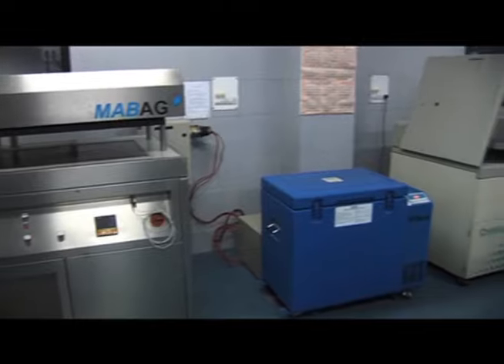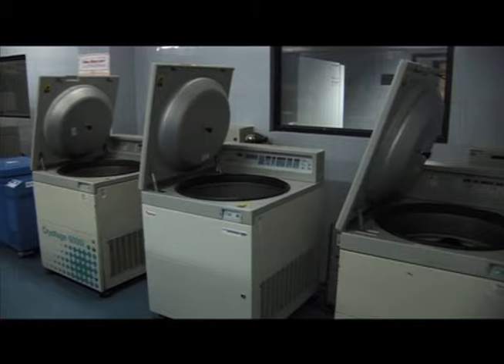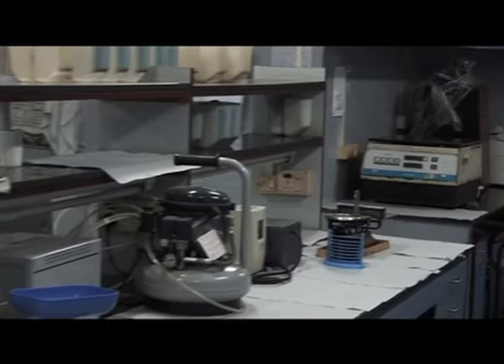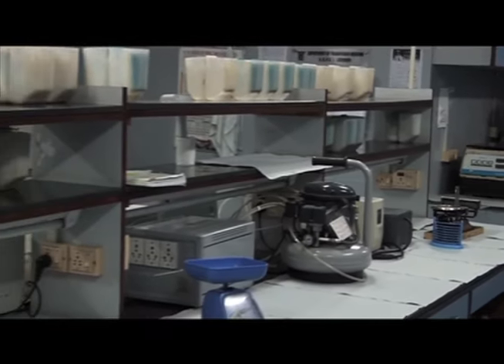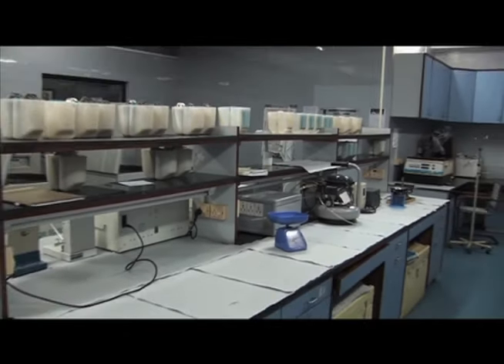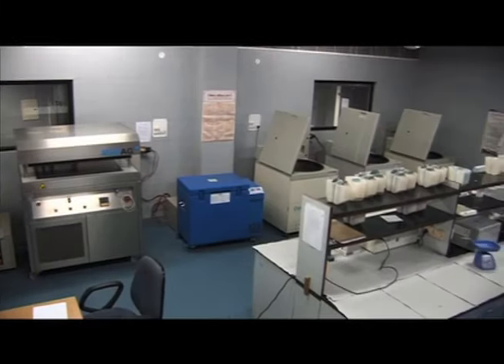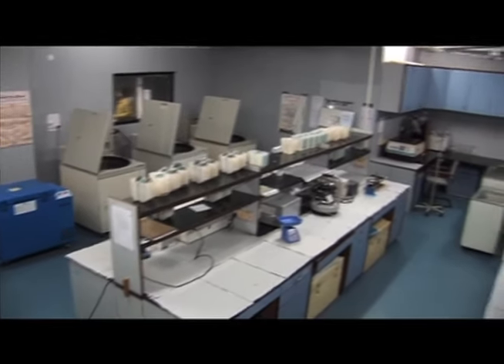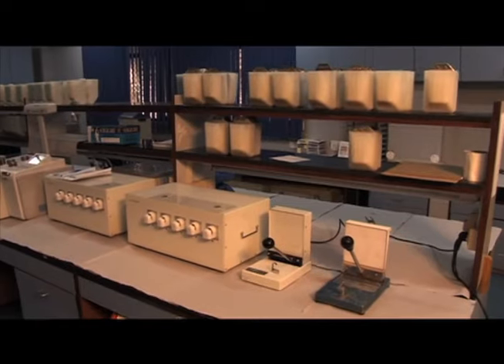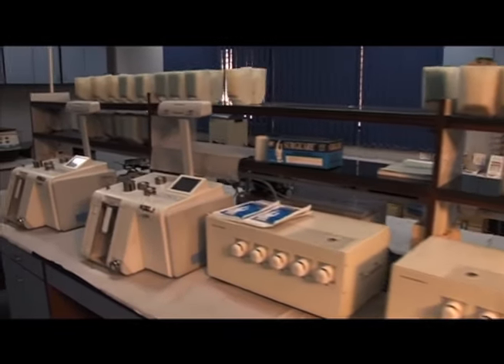For the manufacture of blood products, separate enclosed areas specifically designed for the purpose should be provided. These areas should be provided with airlocks for entry and should be essentially dust-free and ventilated with an air-conditioned supply. Interior surfaces, that is walls, floors, and ceilings, should be smooth and free from cracks. They shall not shed matter and should permit easy cleaning and disinfection.